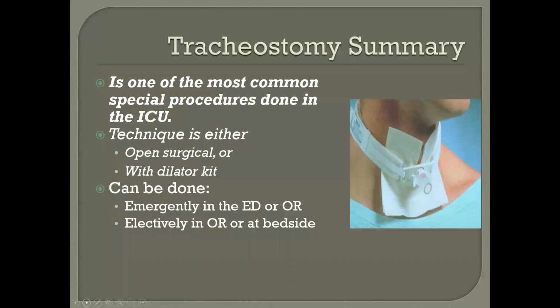And tracheostomy can be done in the OR, also can be done at bedside. It's one of the most common special procedures done in the ICU. Technique is either open surgical, which is really going to be the emphasis here, but for the sake of completeness I wanted to also mention the dilator kit. Can be done emergently in the ED or OR, or electively, in the OR or at the bedside.